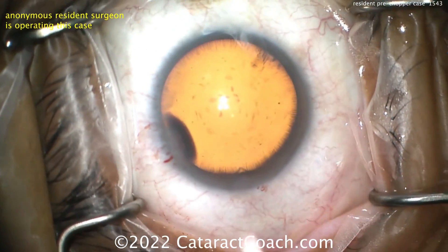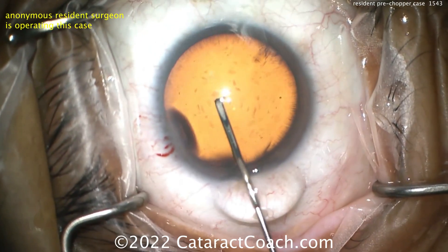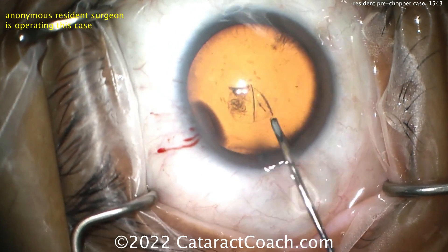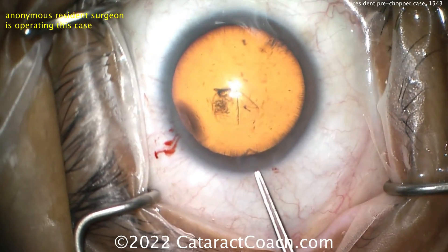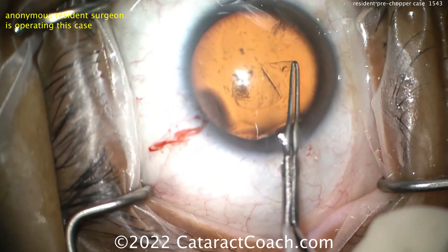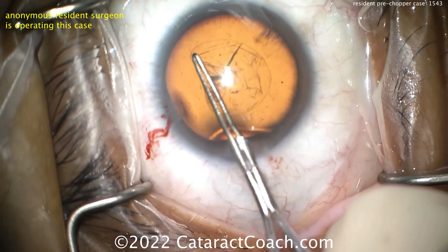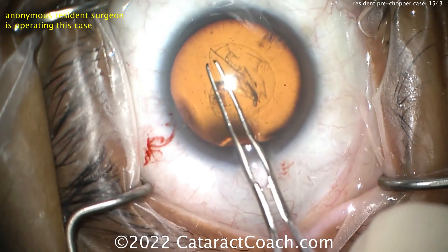There's a bit of a chevron — you see that? Look at the incision. It chevrons because the angle change was too abrupt. Starting off in one plane and then an immediate, abrupt change in angle gives that chevron tip. Look at that sub-incisional area — you see that triangle? That is the chevron sign. When you look at this patient on post-op day one, you will be disappointed to see that chevron sign. You can't have that — you can't go through your whole life making chevron incisions that don't seal as well and are imbalanced.